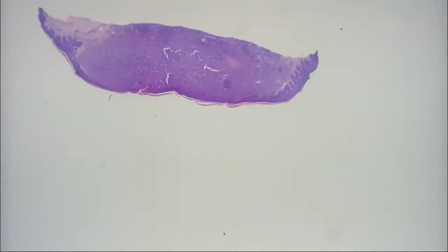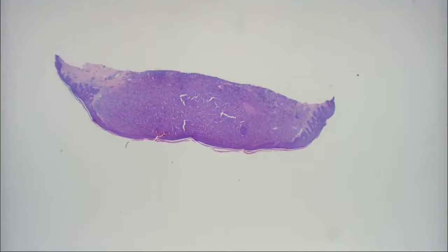Good. So what else did you think of if you didn't think of amyloid? When I saw the dyskeratotic cells and hyperkeratosis like that, without thinking amyloid, one of the things I thought was a BLK, benign keratosis. But you rejected that quickly when you saw the pink material, right? Yes, the pink thing.